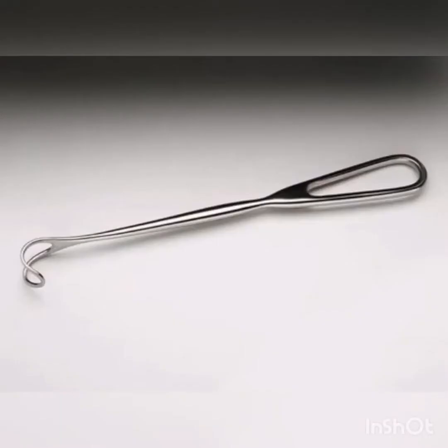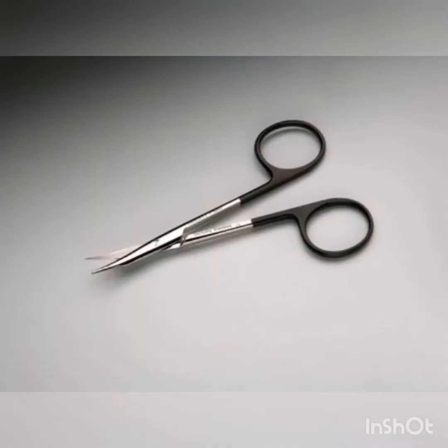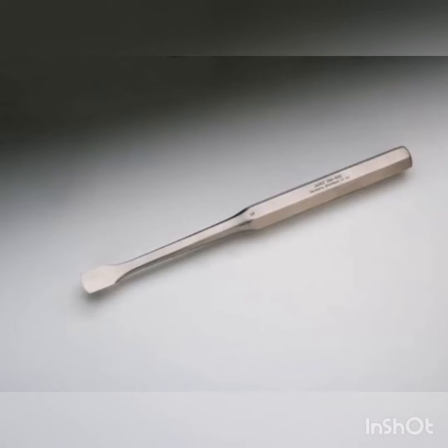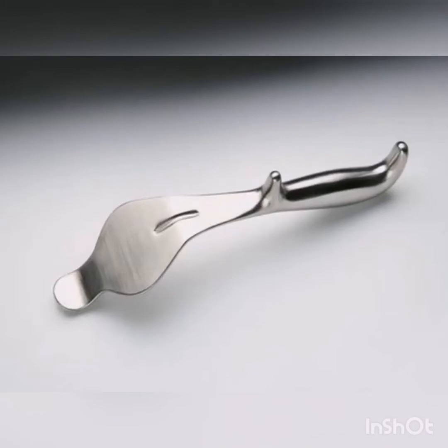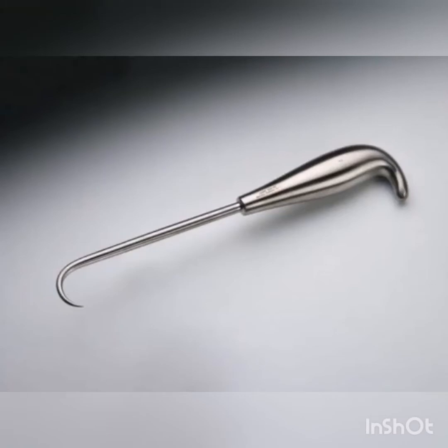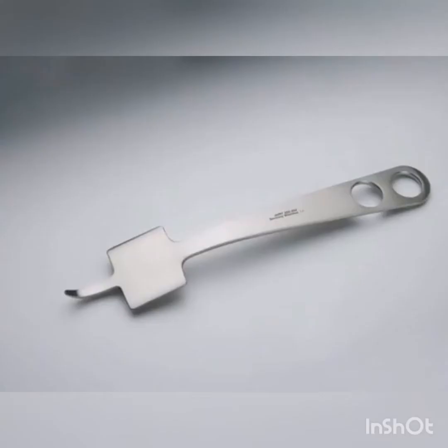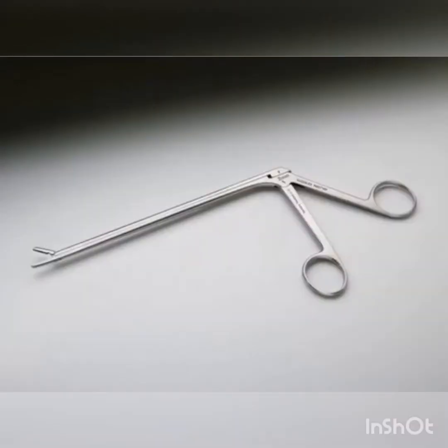Green Retractor. Iris Scissors. Stevens Tenotomy Scissors. Key Elevator. Large Pin Cutter. Bennett Retractor. Hibbs Retractor. Bone Hook. Sharp Hohmann Retractor. Lexcel Rongeur. Cushing Pituitary Rongeur.